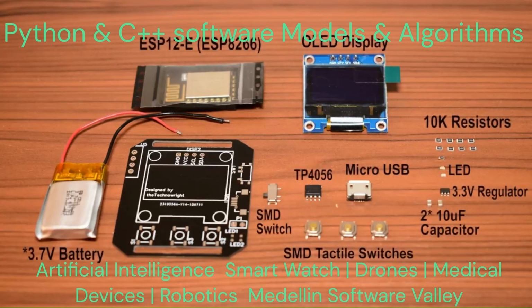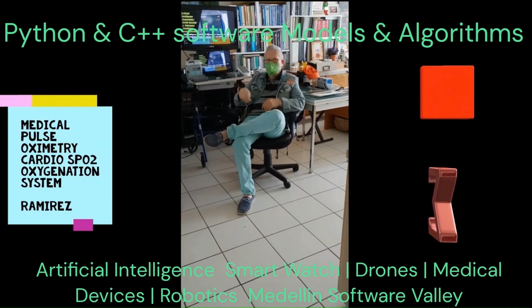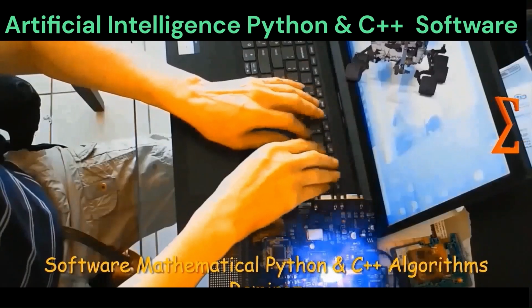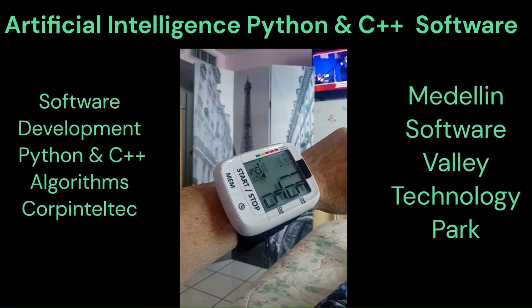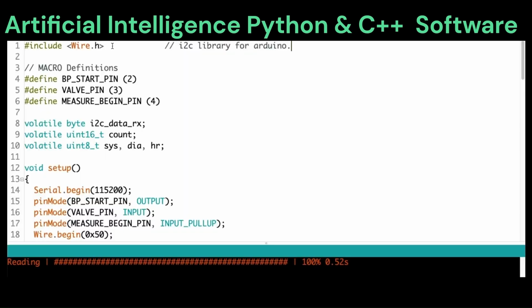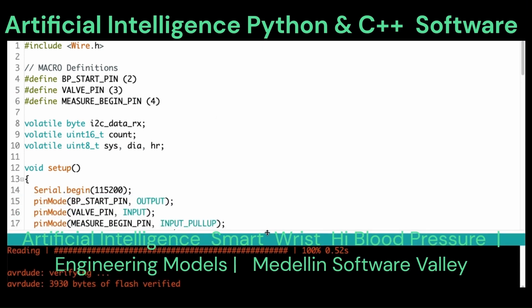inspiration for this workload and this video of my development of the prototype for the blood pressure monitoring system. So the ambulatory blood pressure monitor is designed as a wristband type for higher portability and convenient wearing, such as I have illustrated in this workload and I have shown in this video.